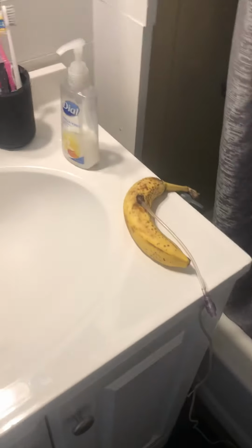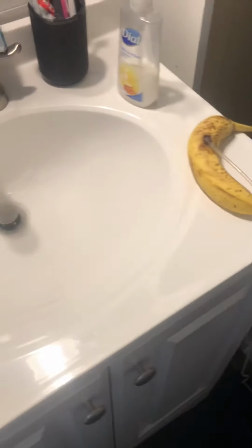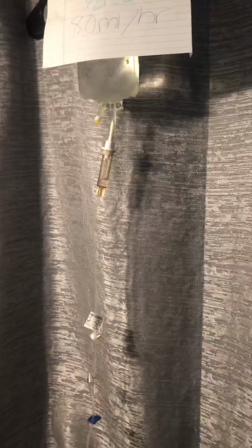Again, we're going to wash our hands. We're going to introduce ourselves again. We're going to ask the patient their name, date of birth. We're going to check their site again. We're going to scan their wristband. We're going to ask for allergies. We're going to pull up the MAR again, scan the wristband again, and check the Lasix one more time. It matches. Remember, our Lasix is incompatible with our D5 half normal saline. So before administering, we want to shut off the machine.